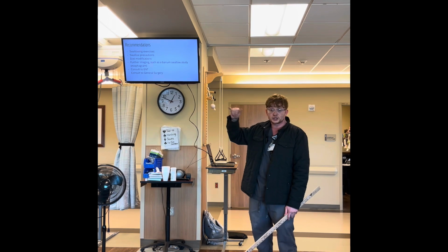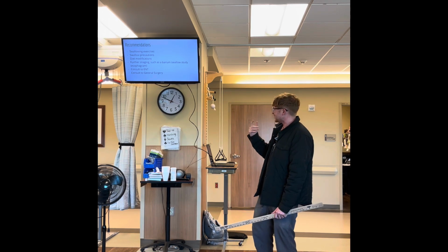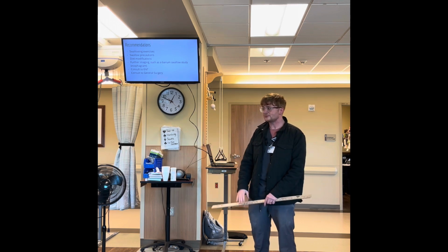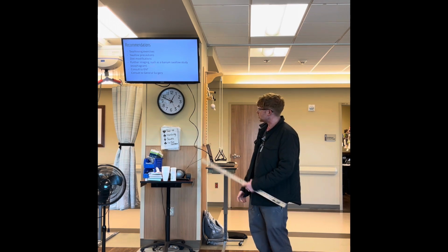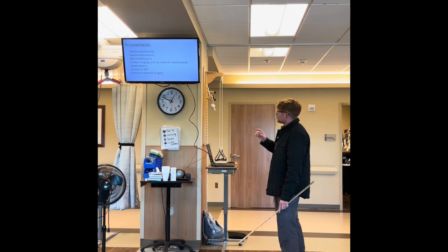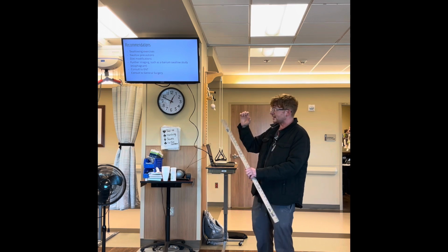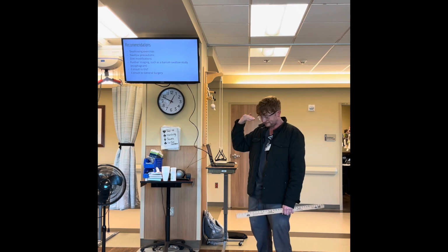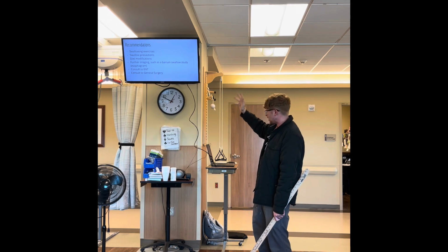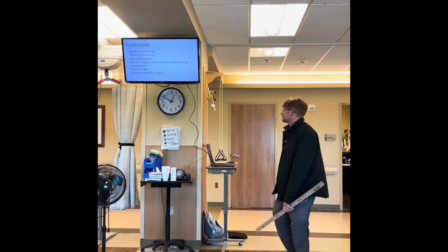Osteophytes, bone spurs on the spine that are out there. If we see those, we can't necessarily diagnose them. That's not in our scope of practice, but the radiologist identifies them, and then we make the proper referral to general surgery to see if we can get them out. Also there are cricopharyngeal bars, two examples, but really they just jut into the back of the esophagus and they create a bump, and that's where things can get hung. And if it's something structurally there, no amount of therapy is going to fix that.